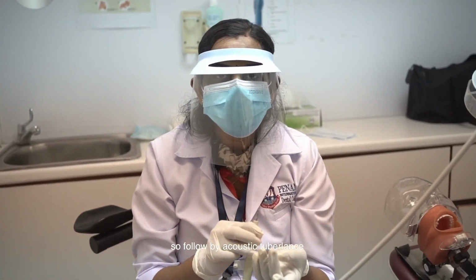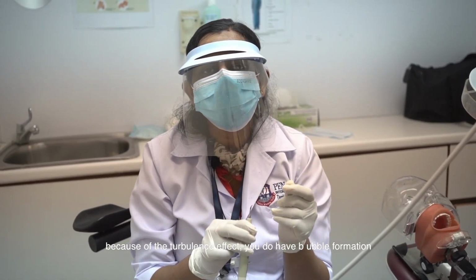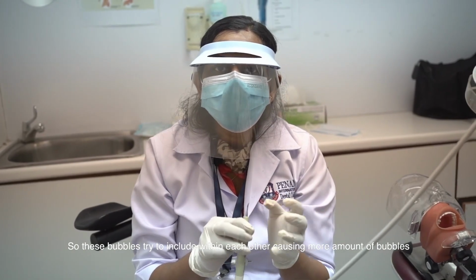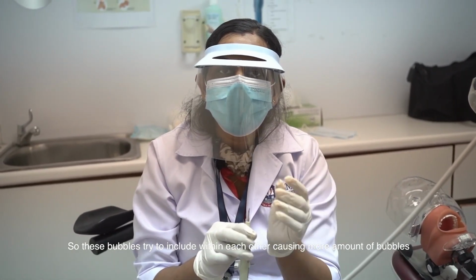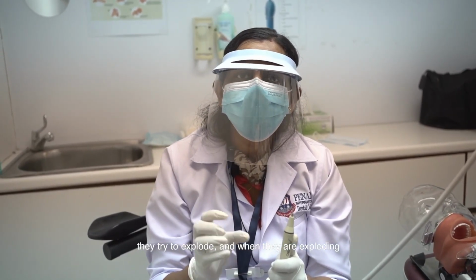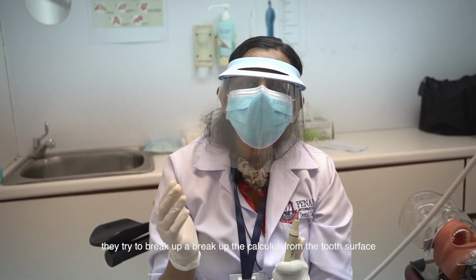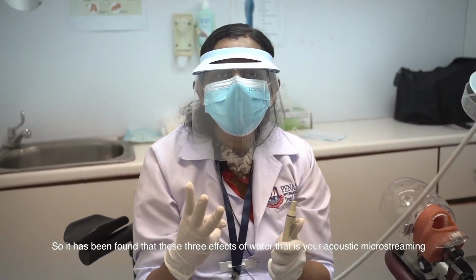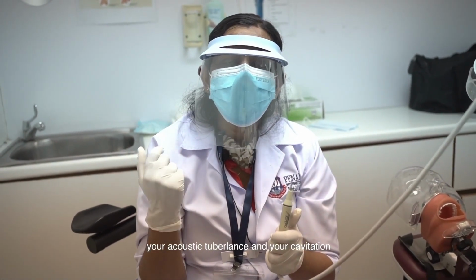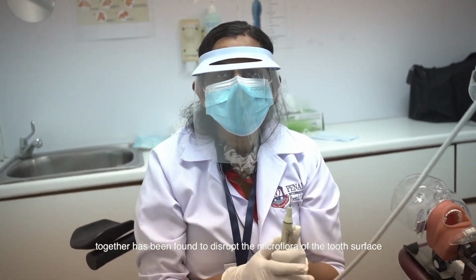Followed by acoustic turbulence, because of the turbulence effect, you have bubble formation, which is called cavitation. These bubbles implode within each other, causing more bubbles, and when these bubbles touch your calculus, they explode, and when they explode, they break up the calculus from the tooth surface. So it has been found that these 3 effects of water, that is acoustic microstreaming, acoustic turbulence, and cavitation, together disrupt the microflora of the tooth surface.